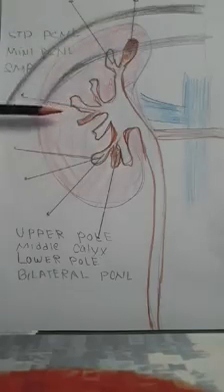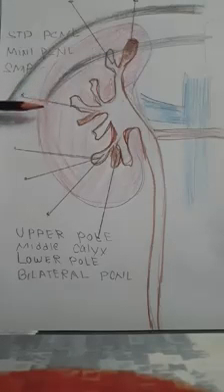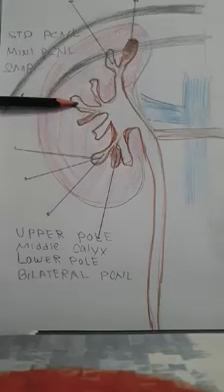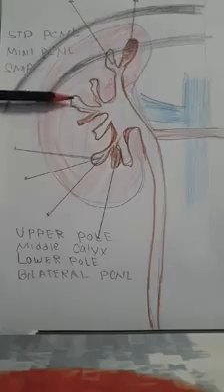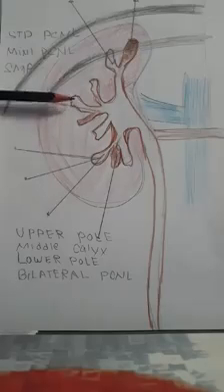Because here, what I do is I look for the tip of the 12th rib. Okay, then in between the 11th and 12th, mostly at the tip of the 12th, I insert my needle, and I puncture the most superficial calyx there. I puncture this one in my 0 degree. Also, if there is no fluid coming, sometimes I can make it 30 degree and see if I am deep or if I am superficial. And by looking at the 30 degree, I know if I am superficial or deep, so I will adjust accordingly.